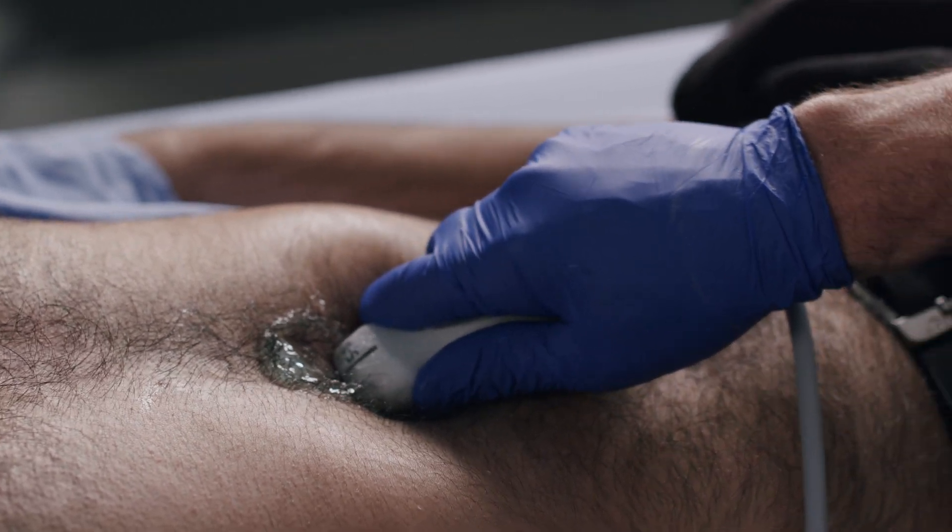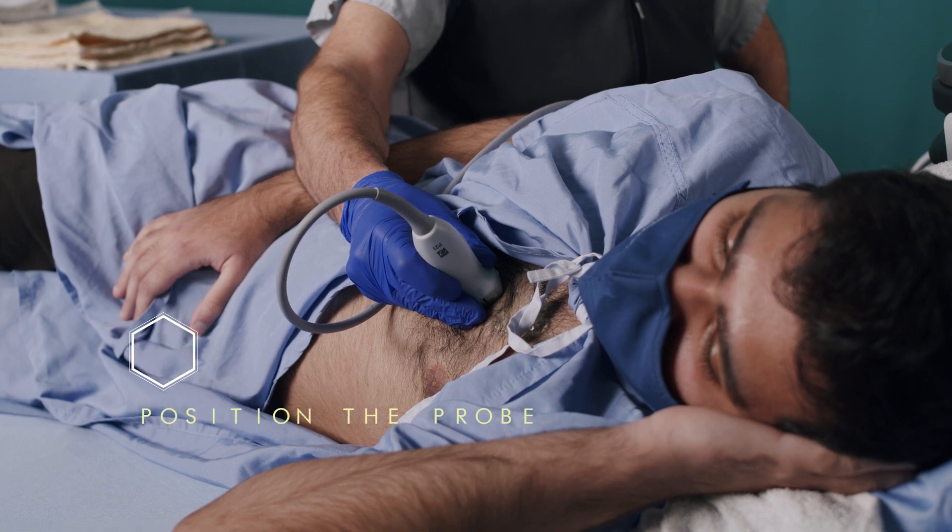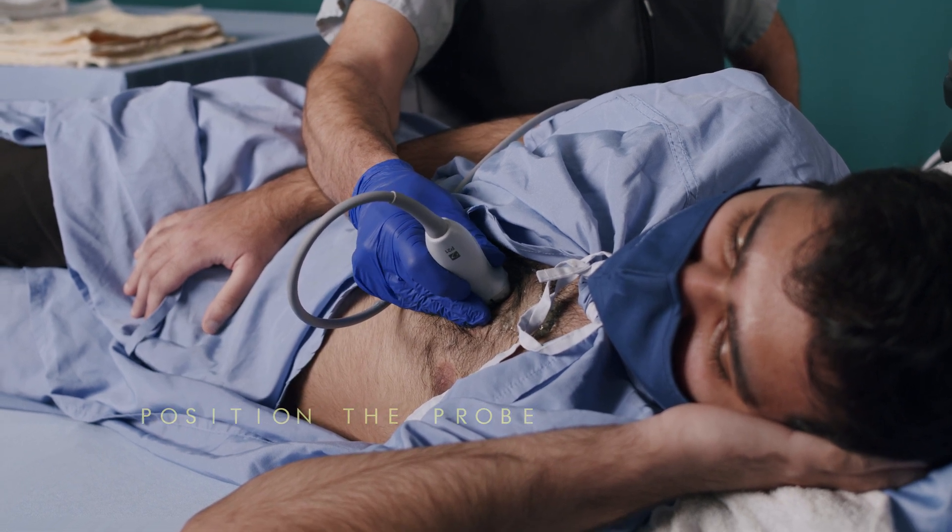Ultrasound gel provides a conductive medium that allows for better probe contact with the skin and better ultrasound propagation. Plenty of gel is essential in patients with narrow rib interspaces and with prominent chest hair. I like to hold the probe between thumb and forefinger and use my other fingers to stabilize the probe position on the chest wall and prevent unwanted sliding.